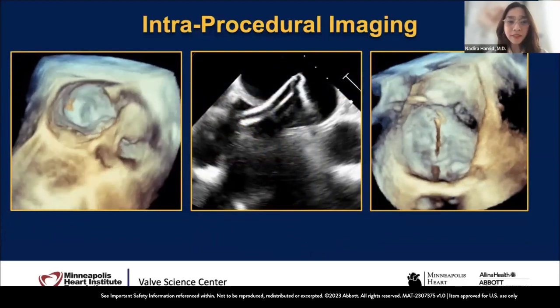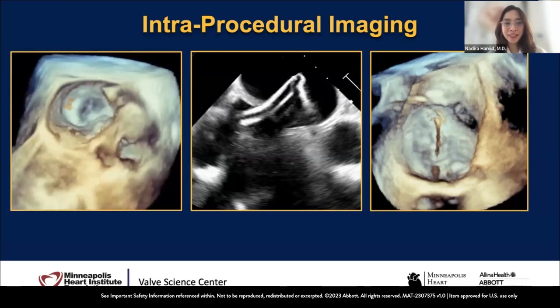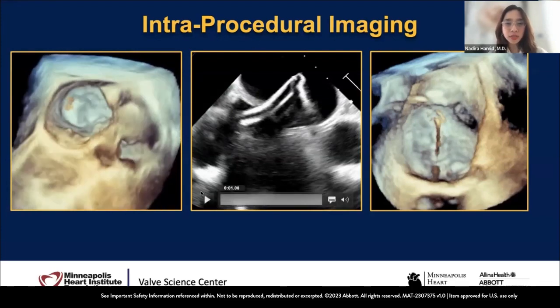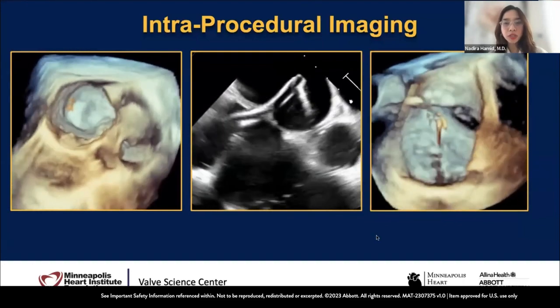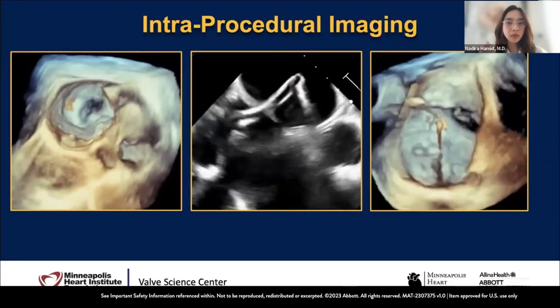And so you can see on the left-hand side a live 3D image. You can see my intervention, like what Ryan would do, poking just to check the height as well, confirming the height of it at 4 centimeters. And then making sure we use both 2D and 3D every step of the way. Whatever Ryan does, I will make sure that he is safe.